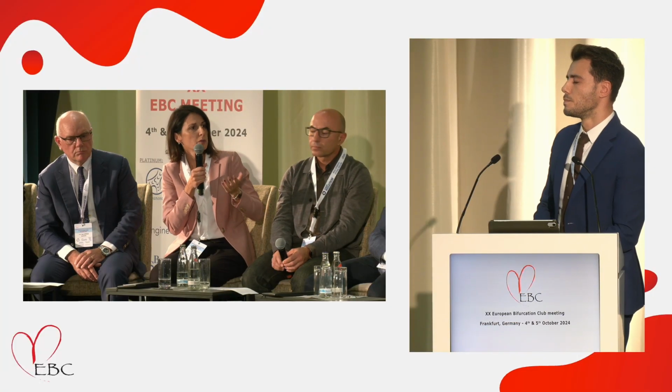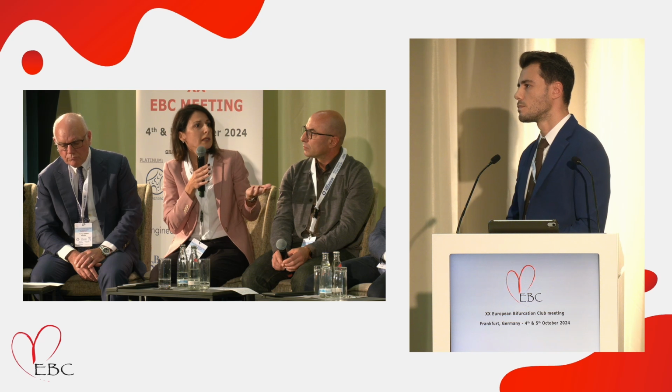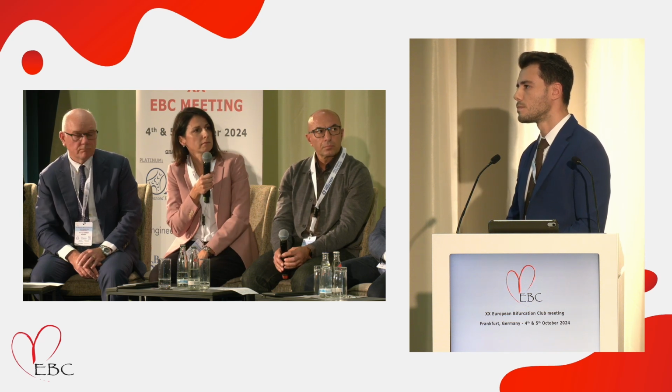So maybe this pot side pot, as you already mentioned, is not so applicable to left main bifurcation lesion. Either crossover stenting and pot, or crossover stenting with pot kiss pot, because of the size of the side branch, which is usually more than 2.75. This is just my remark.